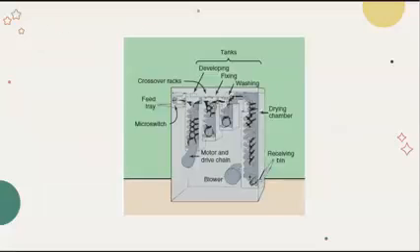So to summarize the parts of the automatic processor. The film is fed in the feed tray. The dimensions of the film should correspond to the dimensions of the feed tray. The short side should be against the side rail and the long side should be the one in contact with the entrance rollers. Within the entrance rollers, a micro switch is in there, and once the micro switch is activated, our replenishment system is activated also.